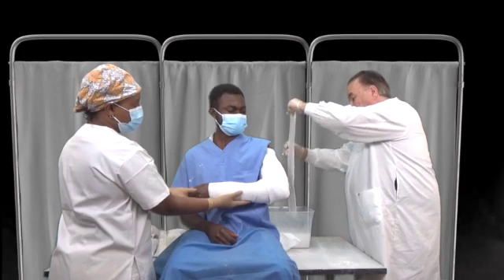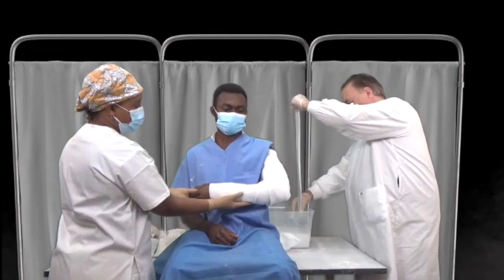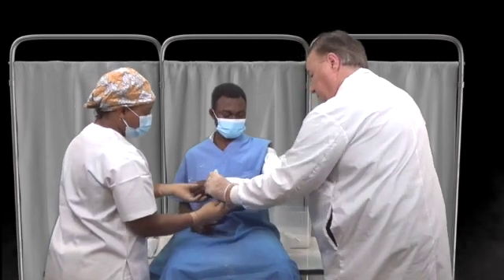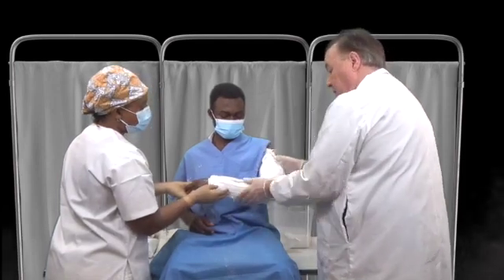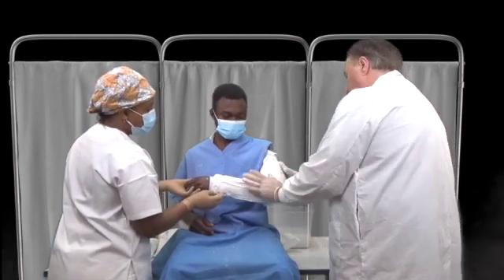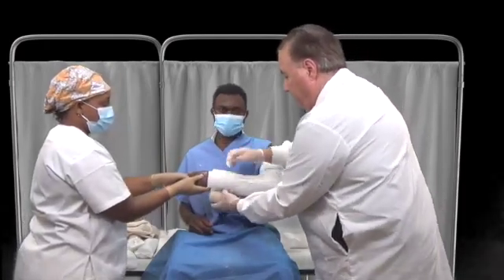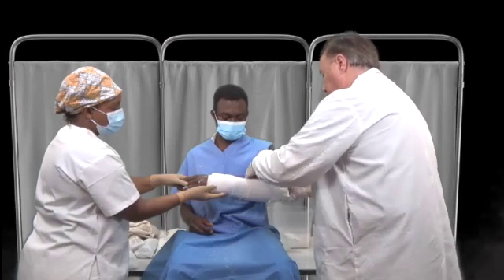We squeegee out the water — we don't want it dry, and we don't want it too wet. We then apply the plaster to the extremity. If it's a bit long, just fold it back. We will secure it in place with a tensor bandage, rolling the tensor gently. I'm not pulling on it or tightening it — we just want it to be secured in place.